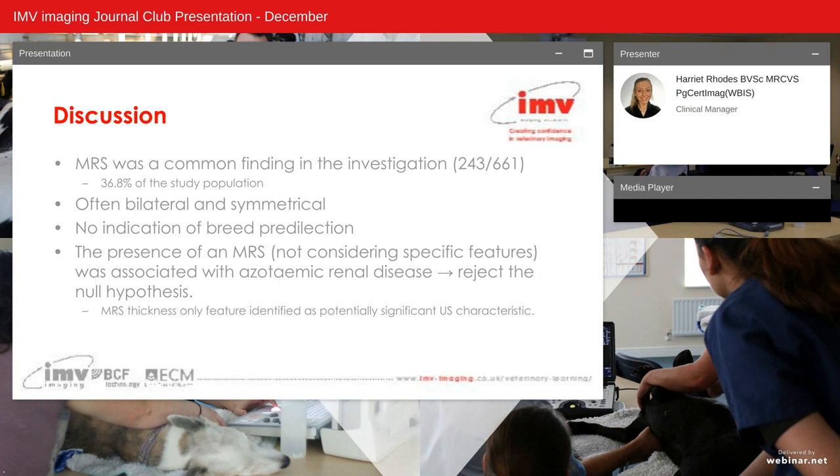The authors weren't surprised by this, and although there was no supportive histopathology for any of the thin medullary rim sign cases in the present study, it is speculated that a thin medullary rim sign likely represents tubular intraluminal deposits as previously described by Jaeger and Anderson. This may then suggest that a thin and thick medullary rim sign represent different disease processes. However, inconsistencies with other studies, notably Mantis and Lamb, suggest that changes in renal echogenicity should always be interpreted with caution when found in isolation.